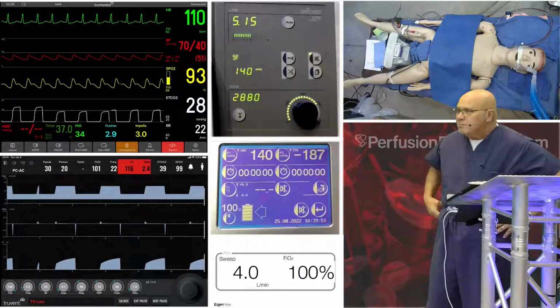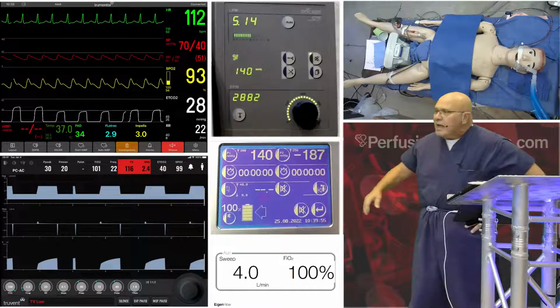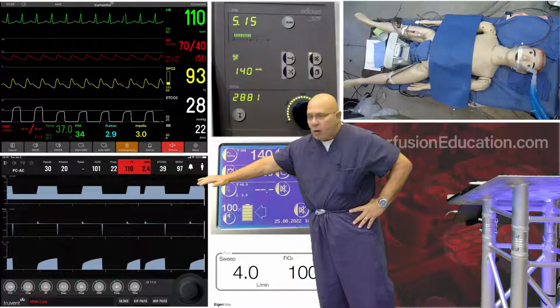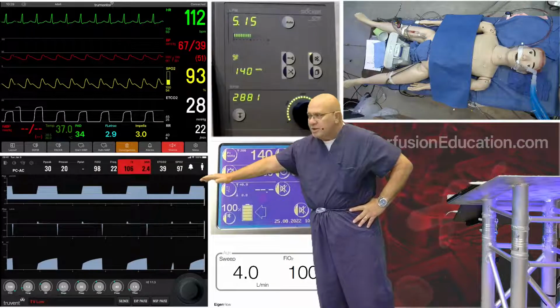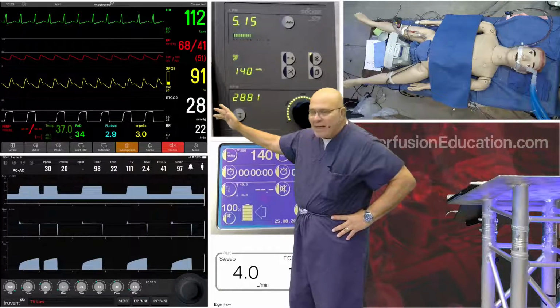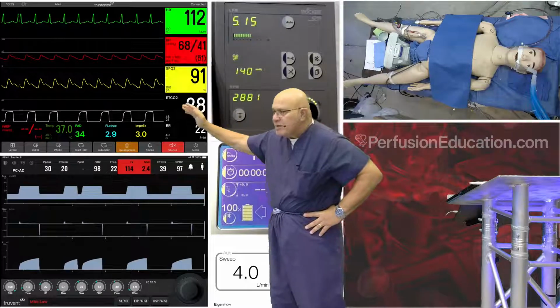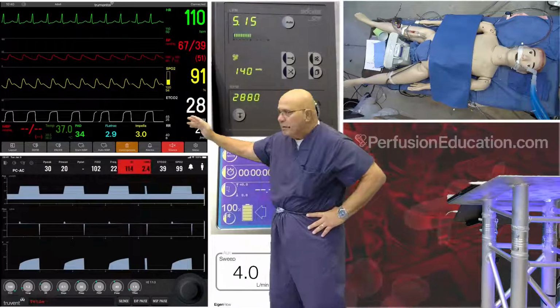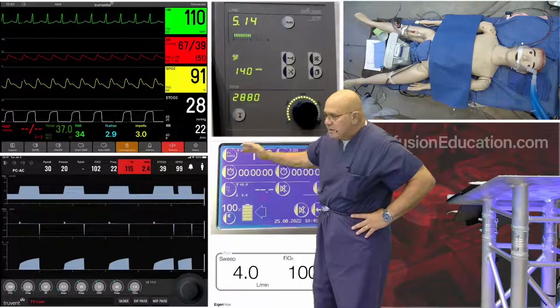That's more where we were at, okay? And you can see our ventilator is still really poor. The lungs are just not working, but the blood pressure maybe made some modest increase, but our saturation is definitely looking a lot better. Our flow has increased significantly.